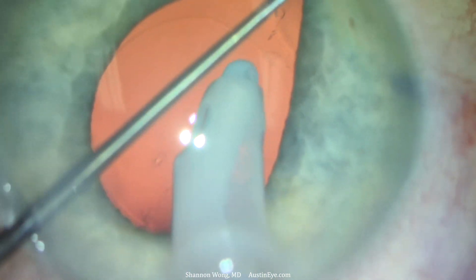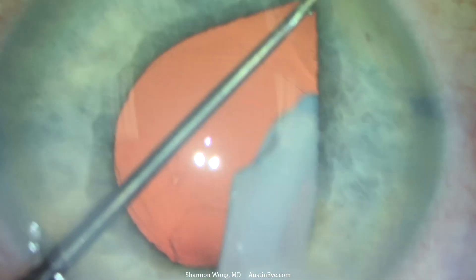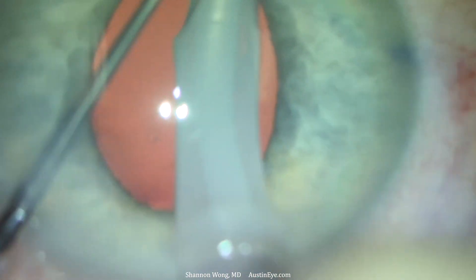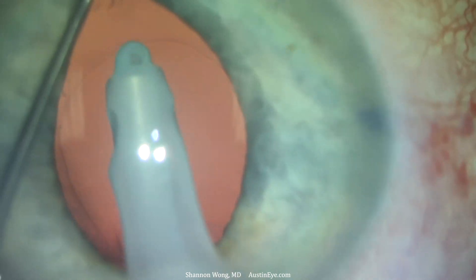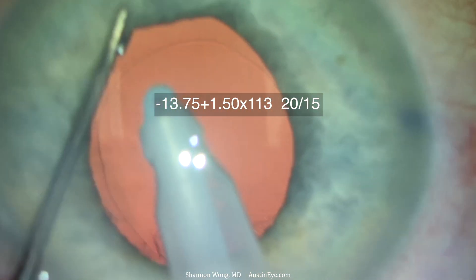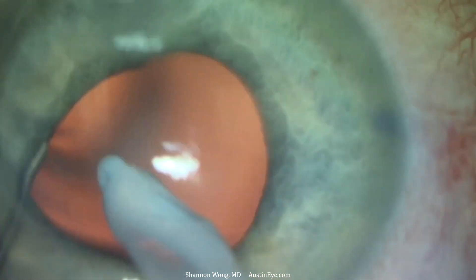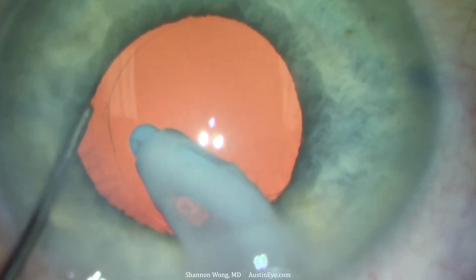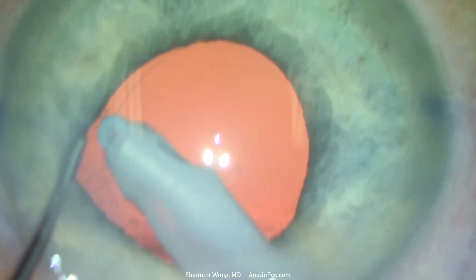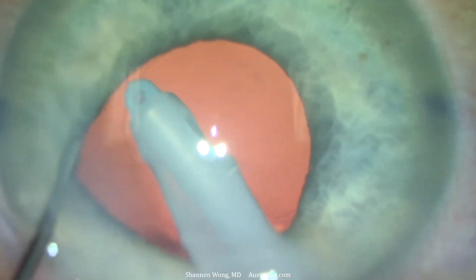This patient is a 55-year-old having laser lens replacement to correct her nearsightedness, astigmatism, and presbyopia. Her pre-op prescription on this eye is minus 13.75 plus 1.5 at 113, yielding 20/15 vision. Like so many of our patients between age 45 and 55, she is expecting nothing but the best, and we expend the time toward that endeavor.